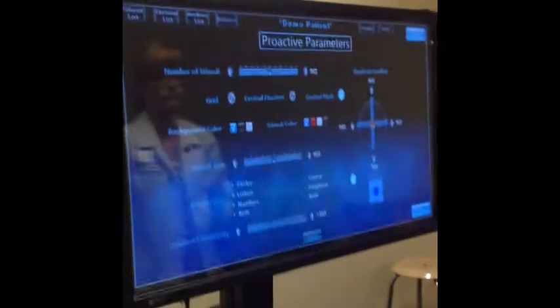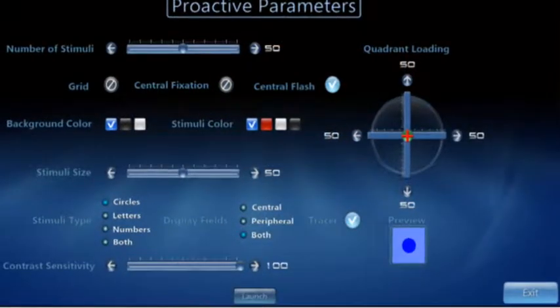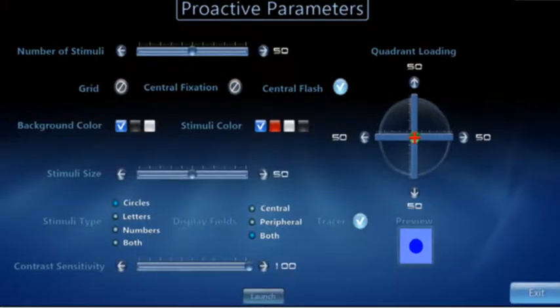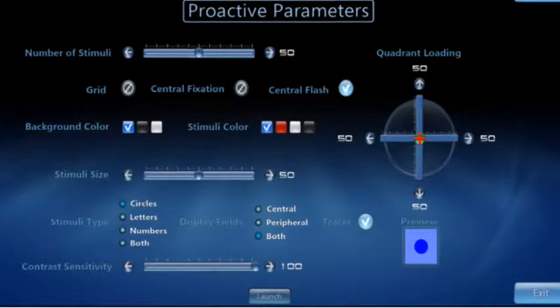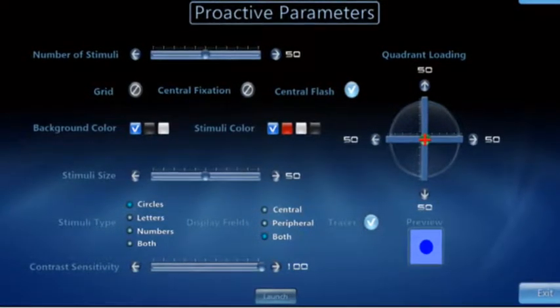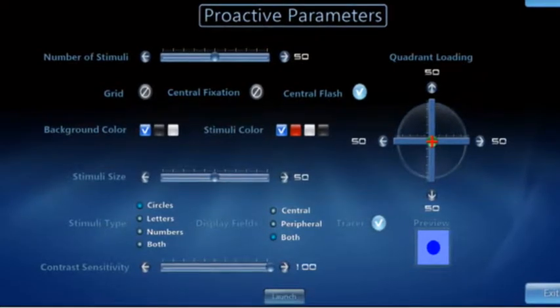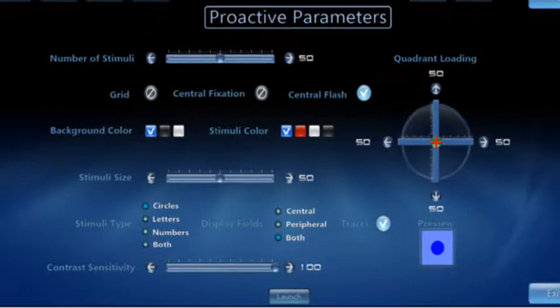Click the Therapy button and click Eye Hand Proactive. Here are the parameters that can be changed for the Proactive section. You can change the number of stimuli, the stimuli color, the background color, the size of the stimuli, what type of stimuli you have, the contrast sensitivity. You can load a certain quadrant with more stimuli, or you can choose to have a grid or central fixation on.